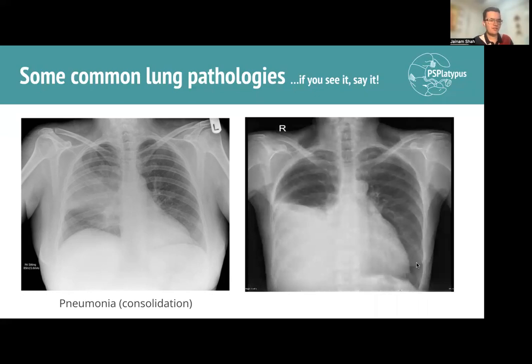And then finally, this one here is very, very extreme, as you can tell. You can see again on the left-hand side, the lung looks quite normal. And you can actually see that costophrenic angle quite nicely, right? It's quite sharp and normal. But on the right-hand side, I mean, it's quite obvious, right? You can't see the costophrenic angle, but also you can't see much of the lung at all past that point.